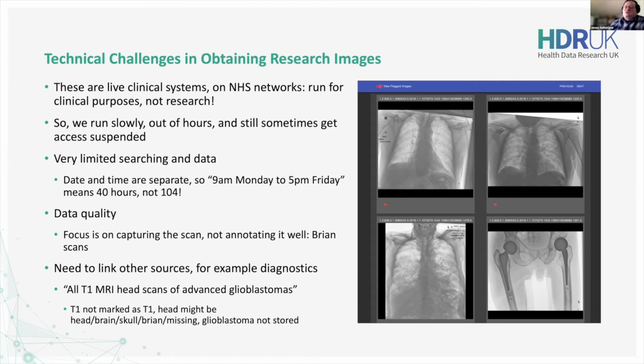If you specify a start time and an end time, you would expect a window of 104 hours there. And in fact, now there's an optional extension to DICOM that you can link the time and date, so you get the 104-hour interpretation rather than the 40-hour version. But of course, because that's optional, you can't rely on the system you're talking to understanding that optional extra. There are all sorts of little complications like that. So your searches are a very complicated, multi-layer construct in some cases. But often it's best to try to keep it simple.